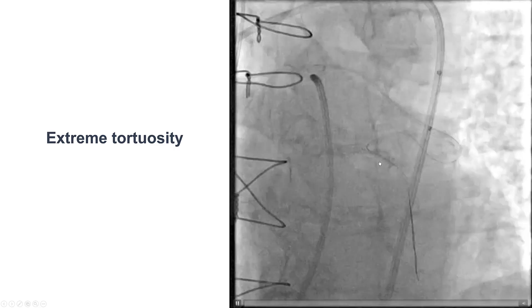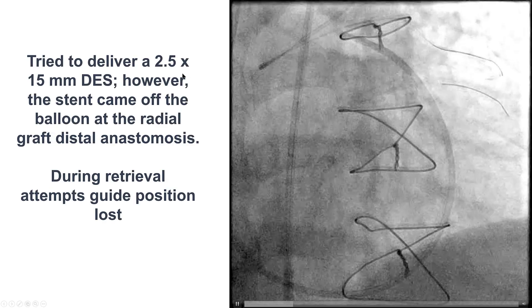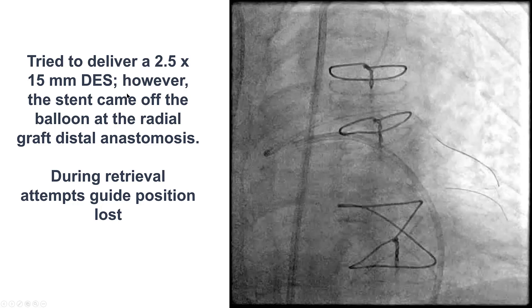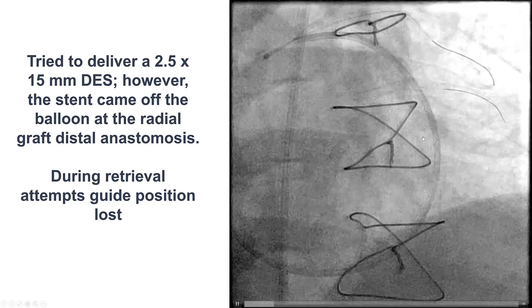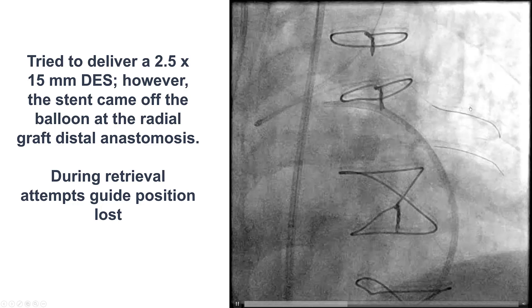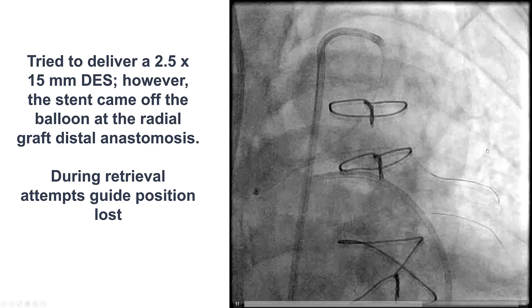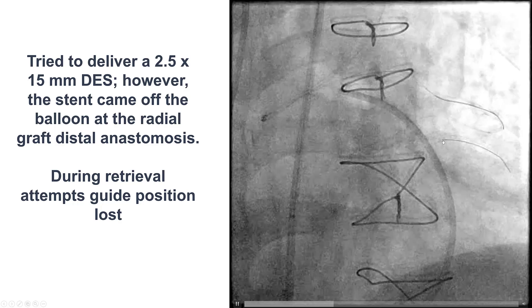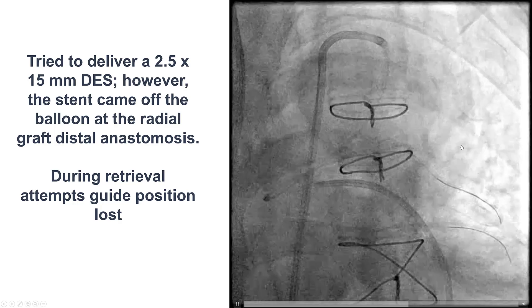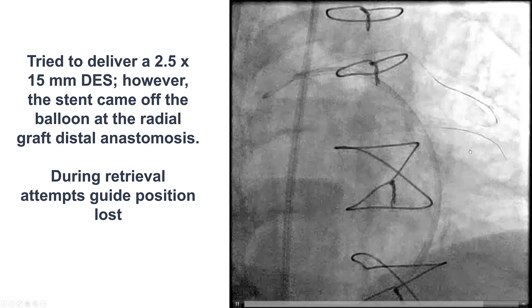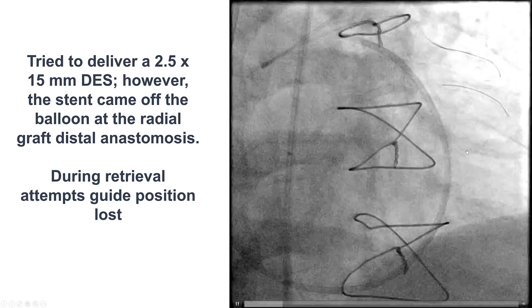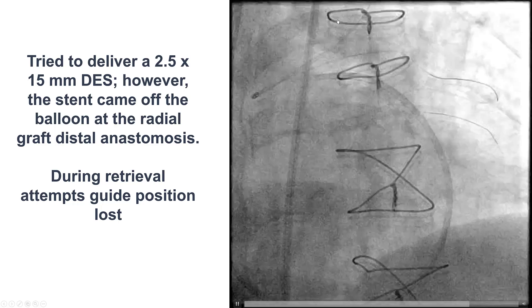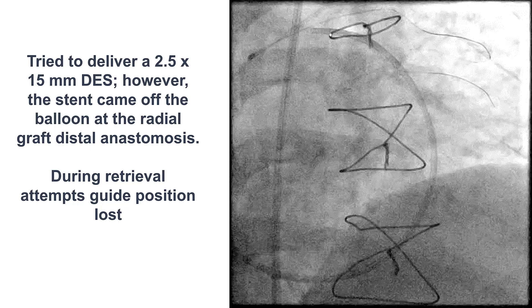You can see the extreme tortuosity. We tried to deliver a 2.5 by 15 mm drug-eluting stent, but unfortunately we could not deliver it. When we were trying to get it back into the guide, the stent came off the balloon and was located at the distal anastomosis of the radial graft. It was a Resolute stent, and those stents are a little harder to see on fluoroscopy. We tried to retrieve it, and actually lost our guide position — the guide was flying out.